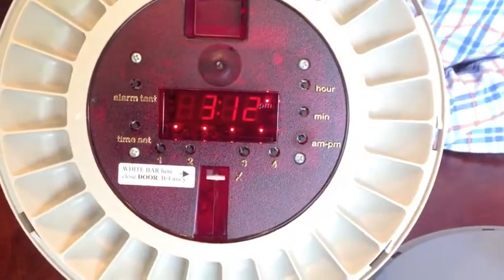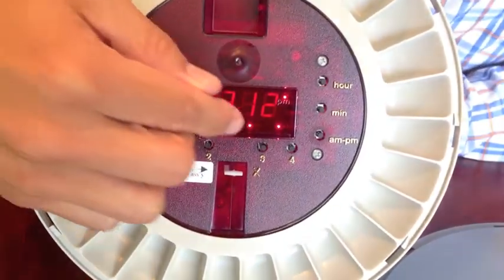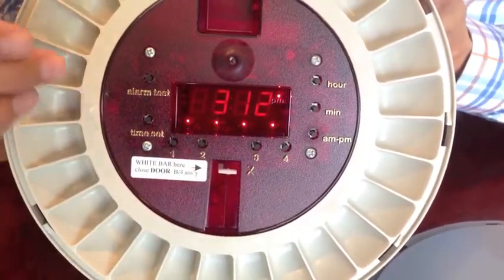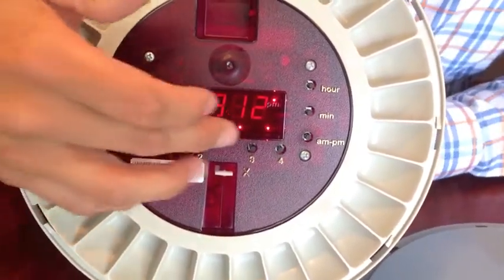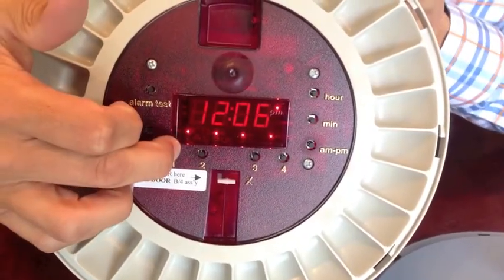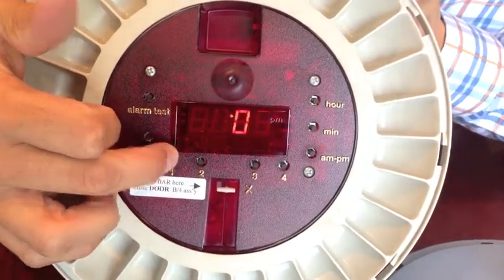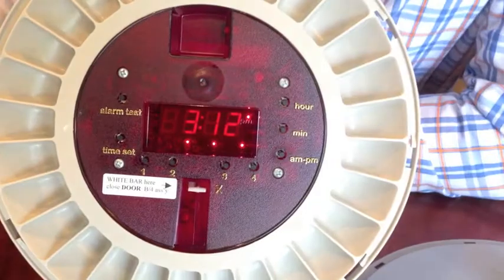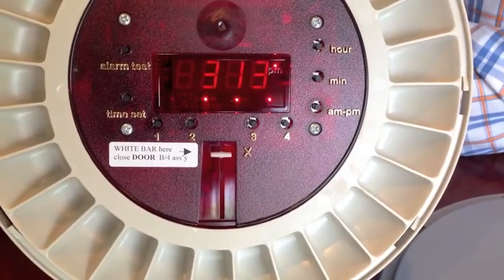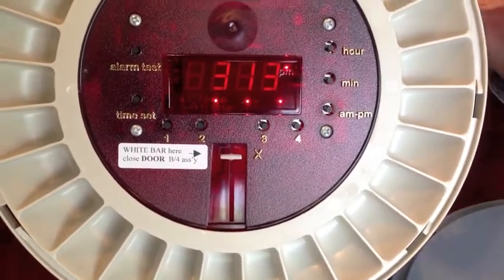Again, just like on the landline version, you're going to want to make sure after you set those that the alarms you need are still active. The only way to do that is to look at the lights across the bottom here. If the light is on corresponding to the button right below it, then it's active. If it's not and you need it on, just simply press and hold that light and that will either turn the alarm on or off as you need it. You're going to want to make sure that the AM and PM is set properly for all your alarm times so that it goes off at the proper time.